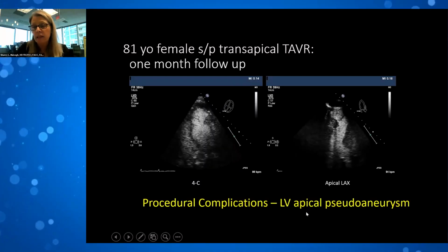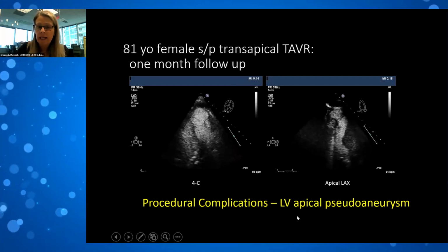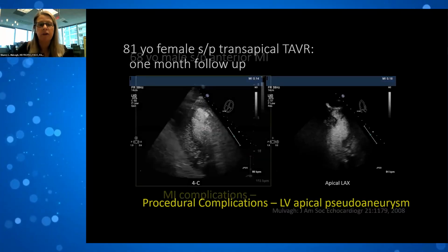And this is actually recognized in about 2 to 3% of the cases that are done transapically. So this can be very helpful.